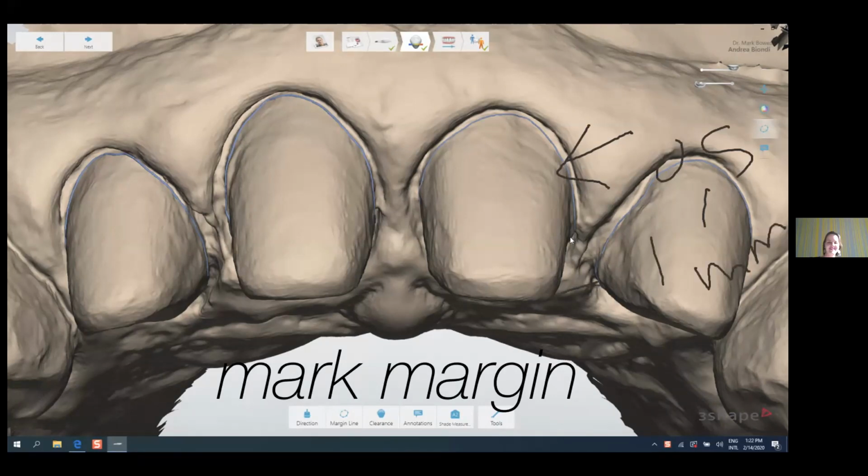Biocompatibility of zirconia and soft tissue. So, you know, again, this is a match made in heaven, in my opinion, when we start to place these margins. And there's also been a lot of research about the fit being much better on a vertical type feather edge versus horizontal. And it's impossible, if the lab understands where to place the margins, to violate the biological width, because we haven't placed a horizontal margin. Versus, obviously, if you've prepped slightly too deep, that's it, you can't move that margin. In other words, you're going to get inflammation.